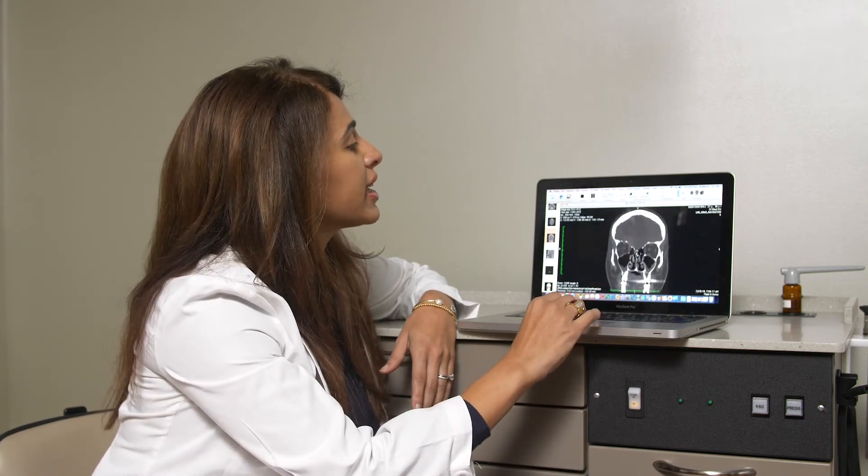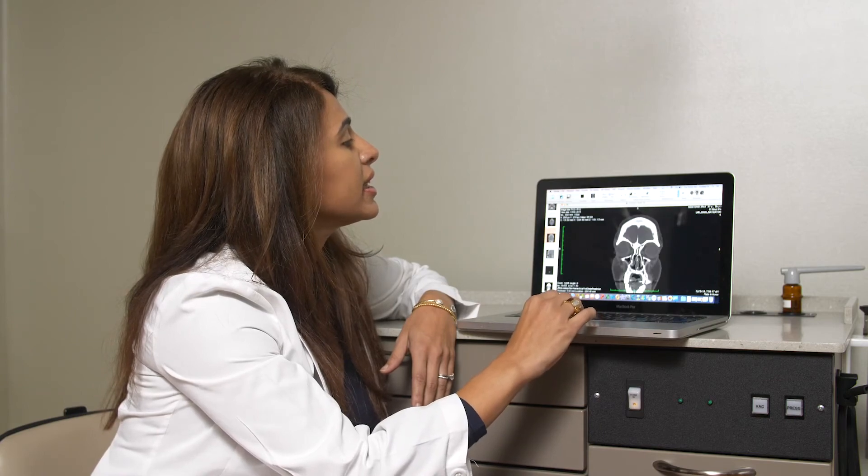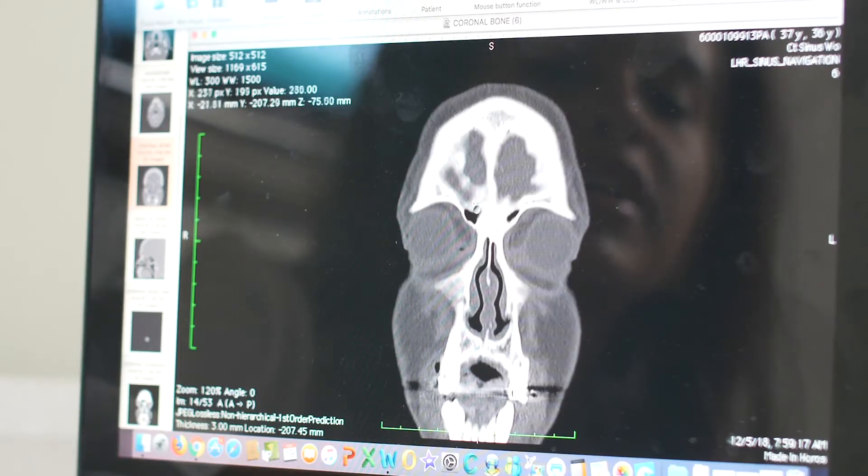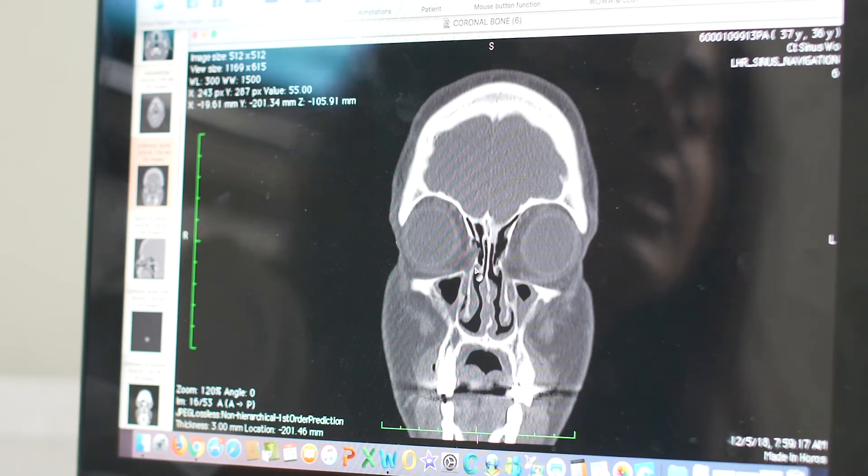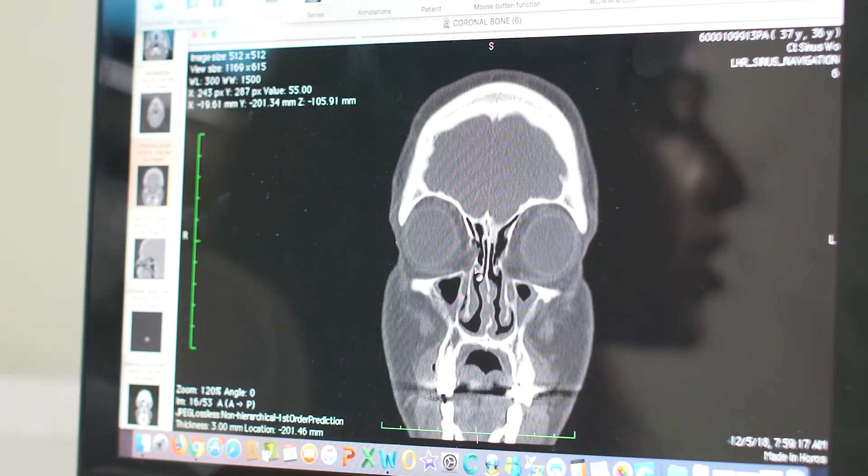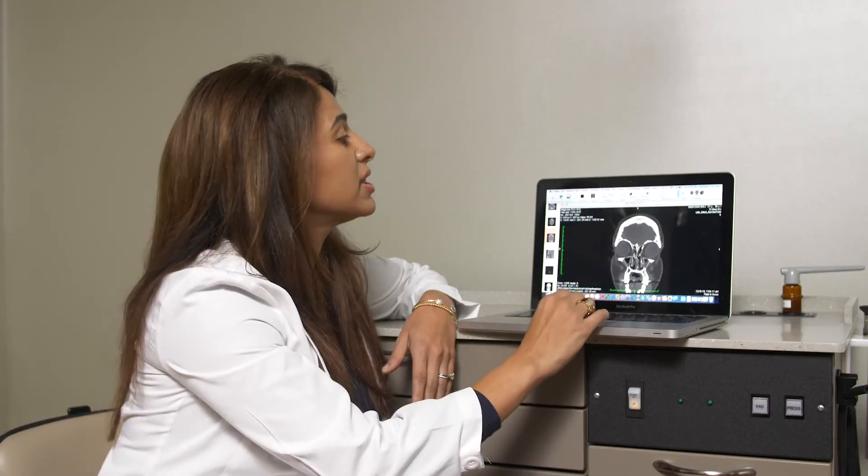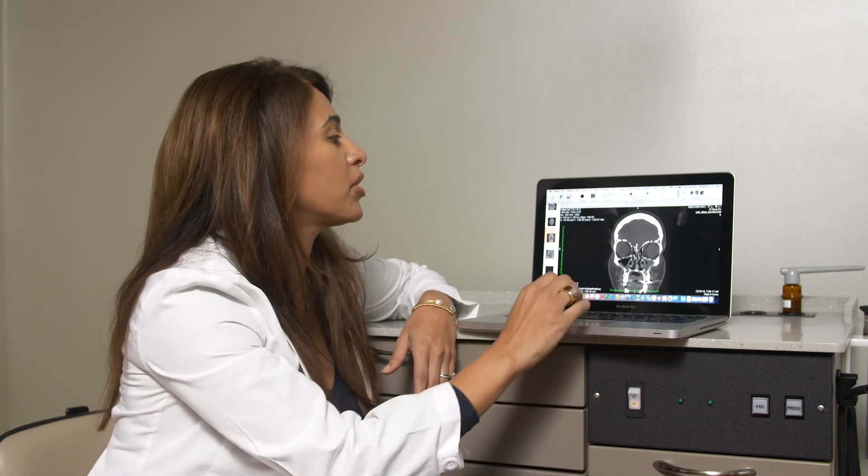So in this particular scan, you can see that the patient has very underdeveloped frontal sinuses. That means that they are really small, and the passages leading to them are also really tight and small. So that situation makes it more difficult for a patient to deal with a little bit of inflammation. So they're going to end up with a little more sinus disease.